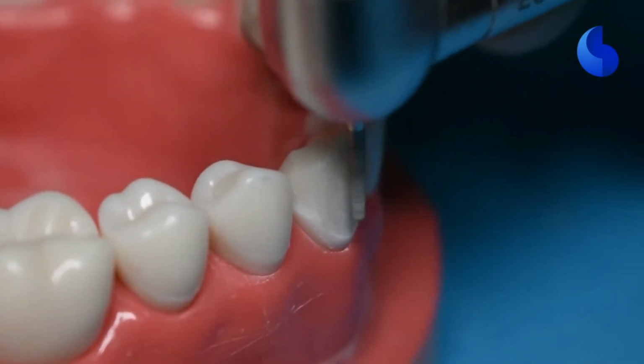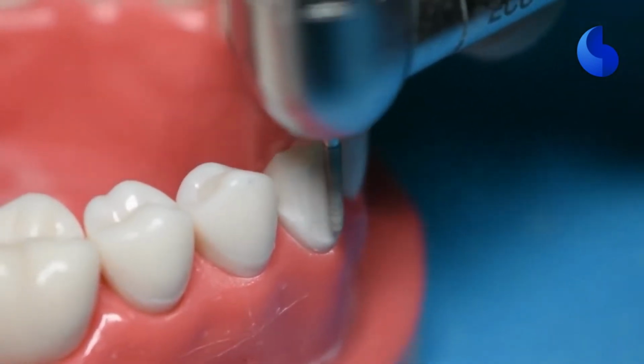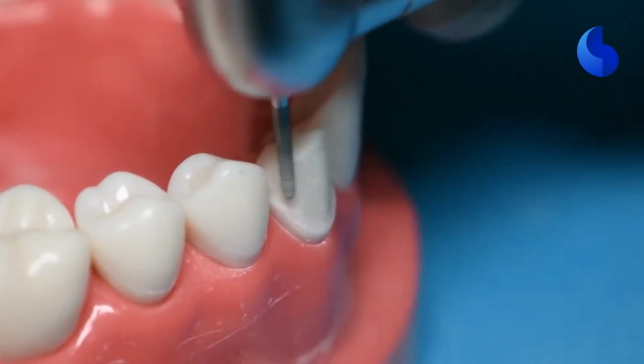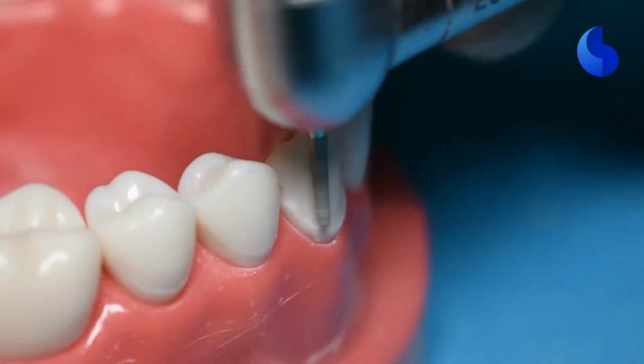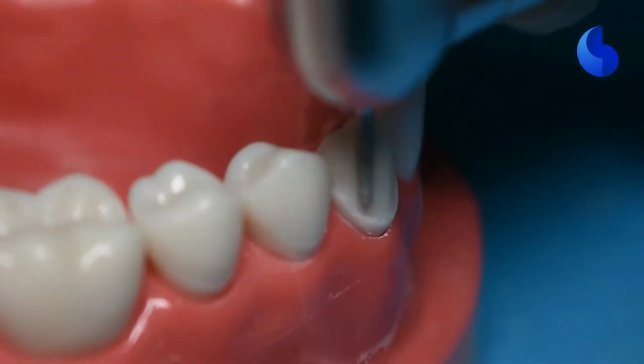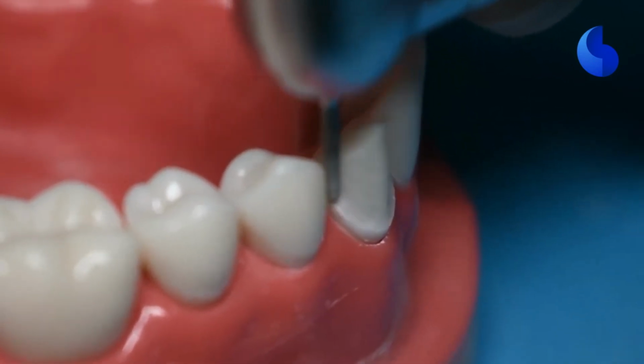So we're moving it gingivally, and we are ensuring that our margin is not going further gingivally or getting wider. We are simply refining it. And you take your burr interproximally so you can create a smooth flowing transition between the lingual and the buccal surfaces.